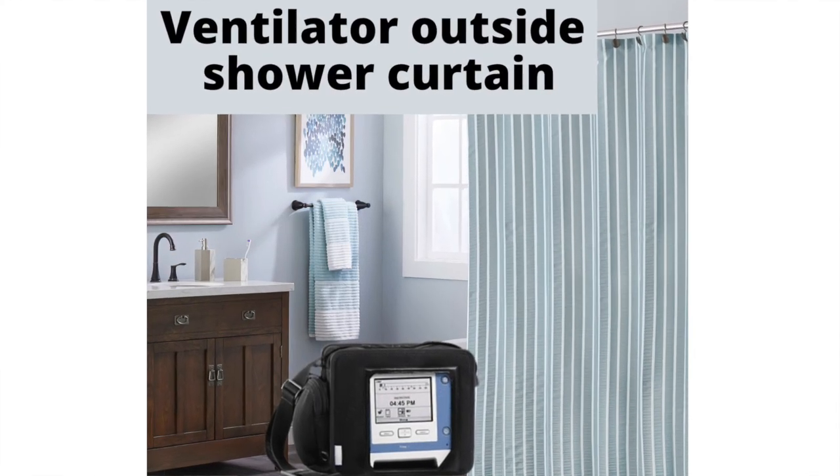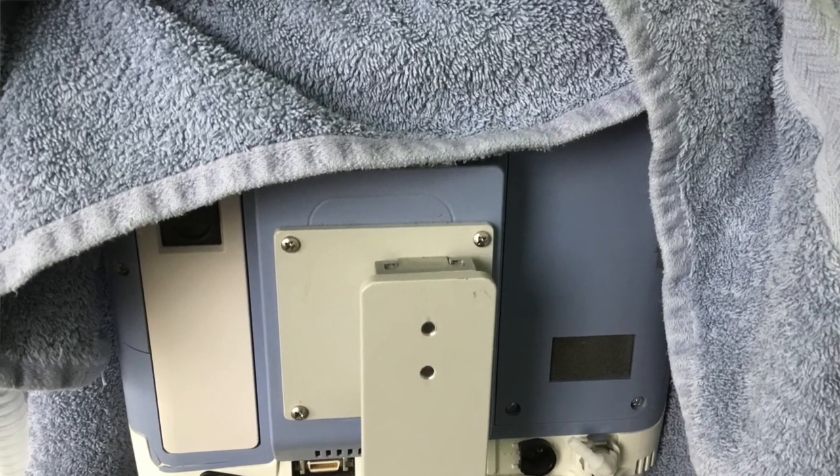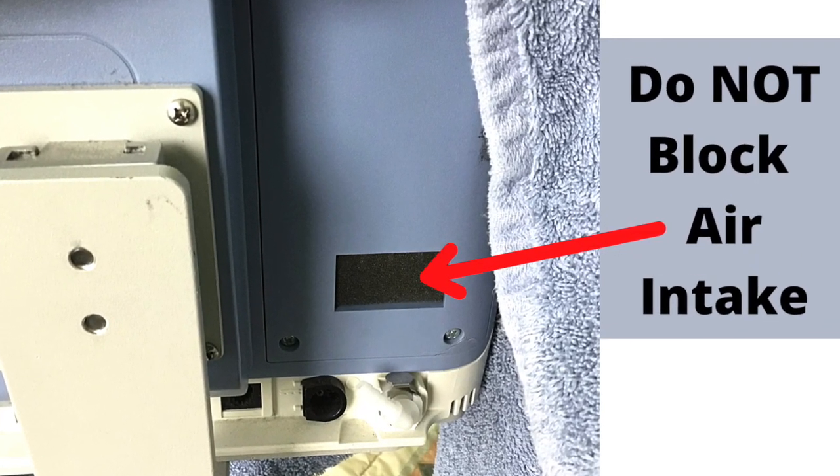If you use a ventilator to breathe, you will need to keep your machine dry. Do not place the ventilator inside the shower. Instead, place the ventilator outside the shower. Place a towel over the ventilator to protect it from getting sprayed with water. However, do not block the ventilator's air intake channel.